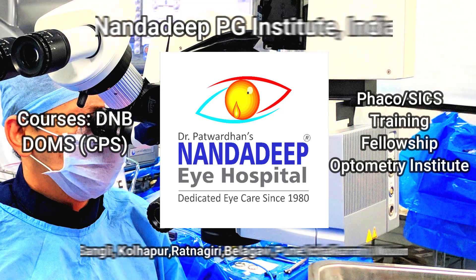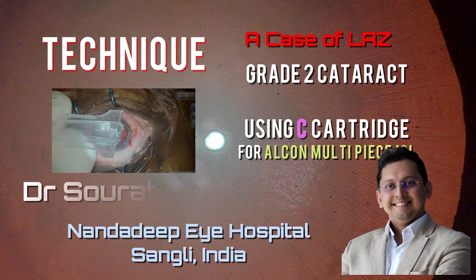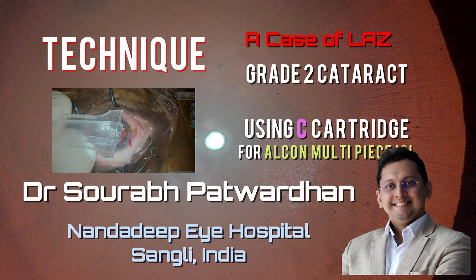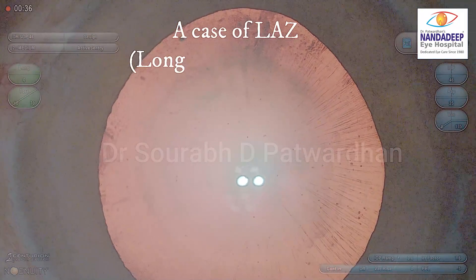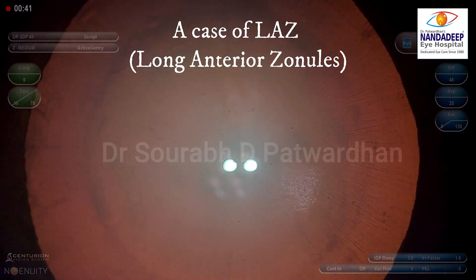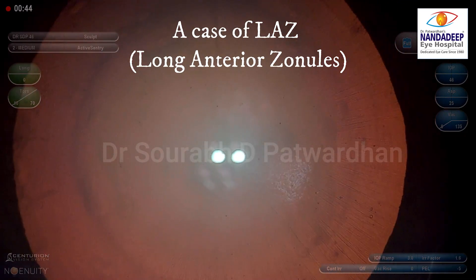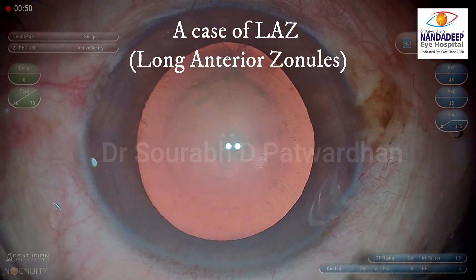In this video, I will be discussing a case of long anterior zonules and grade 2 cataract, and I am going to show how to use a C cartridge for Alcon 3-piece IOLs. You can see those zonules which are inserted quite anteriorly — they are coming almost within 3 to 4 mm of the anterior lens capsule, and we call it long anterior zonules.